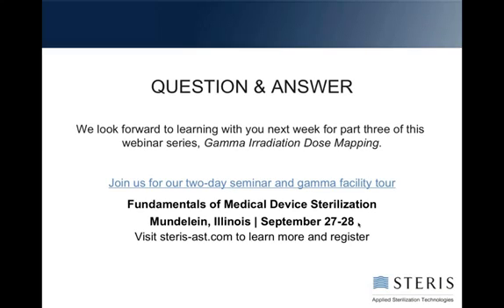So I wouldn't recommend using them because they don't give you any value that the validation process and verification dose don't already give you. And you're also using, in radiation, dosimetric release. So you're always measuring each batch you release to assure that it's gotten the appropriate dose to claim sterility.